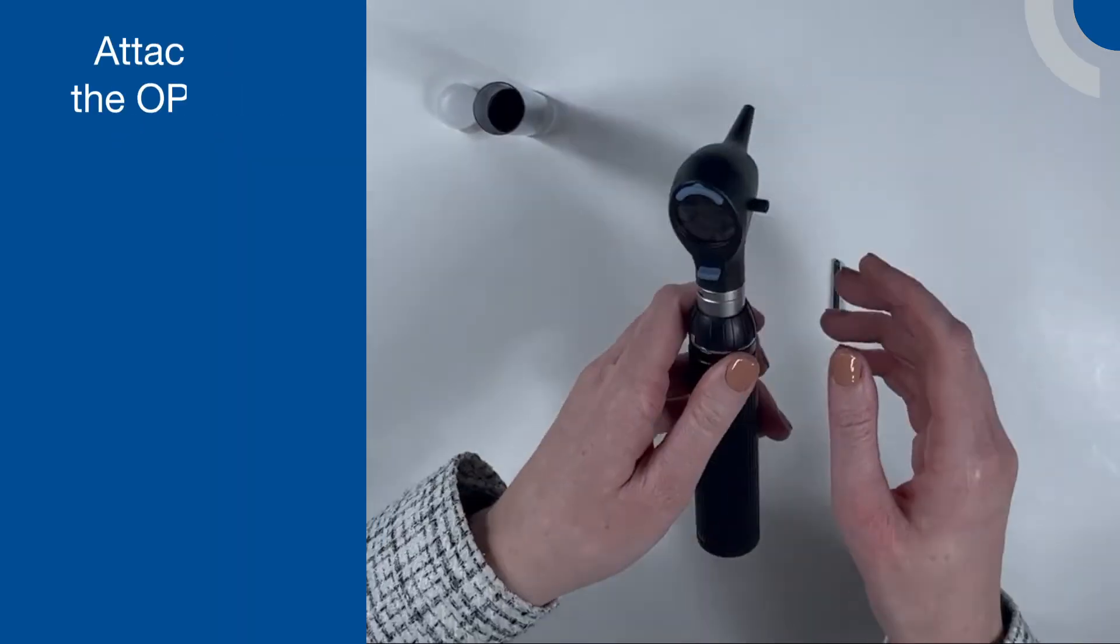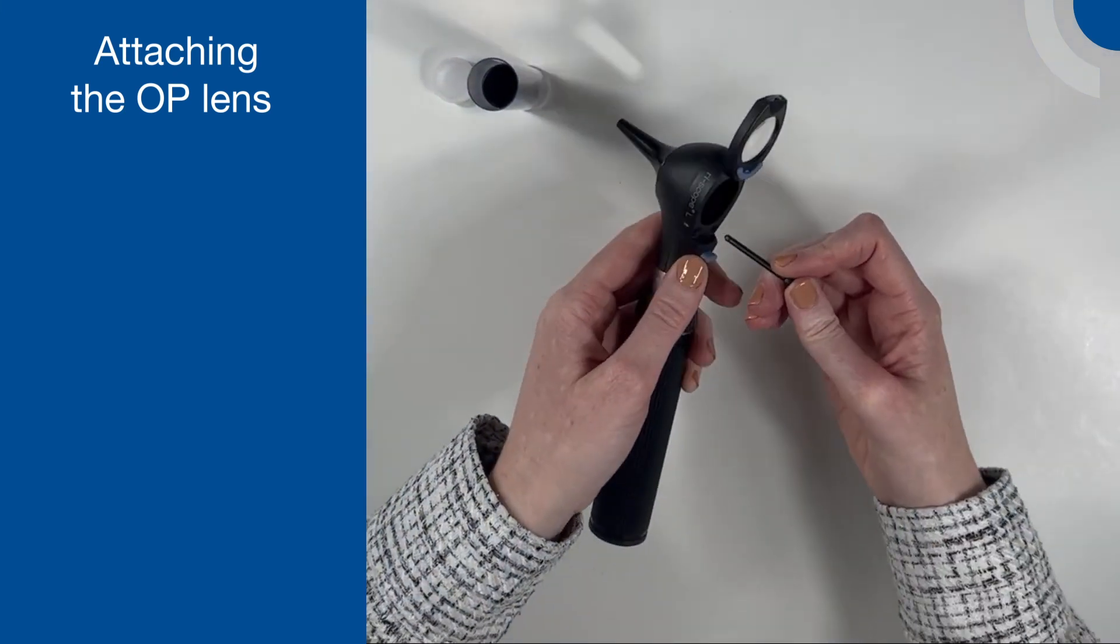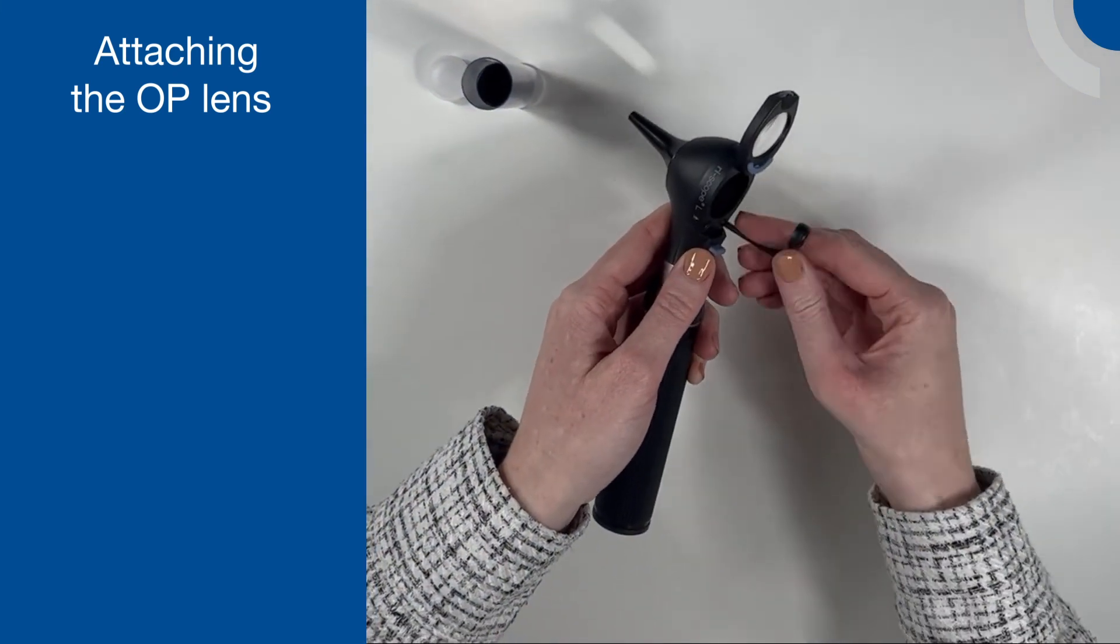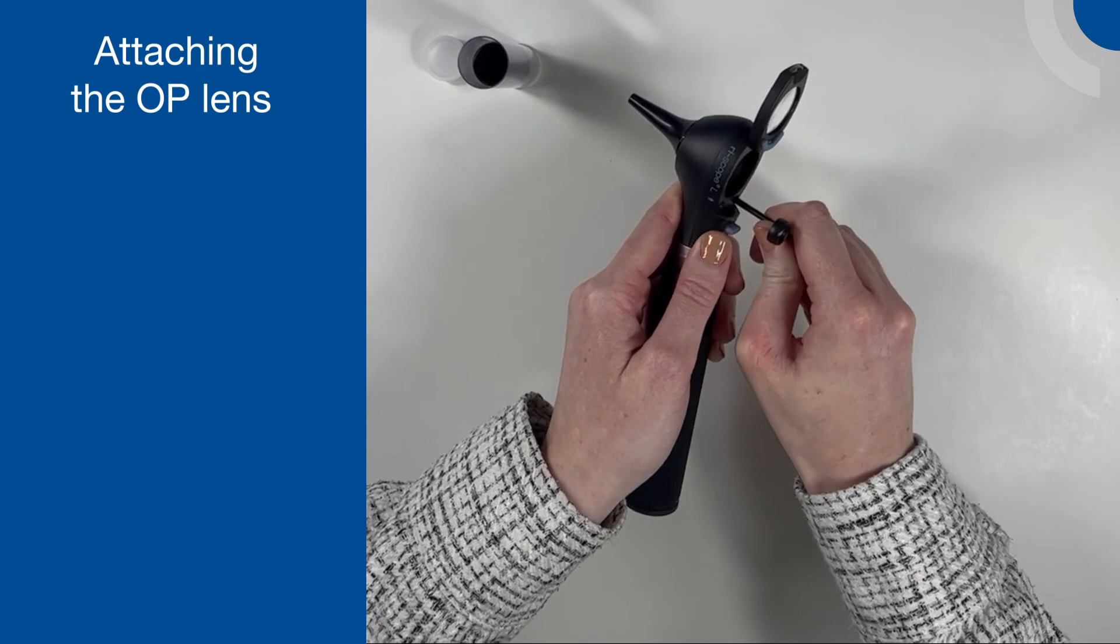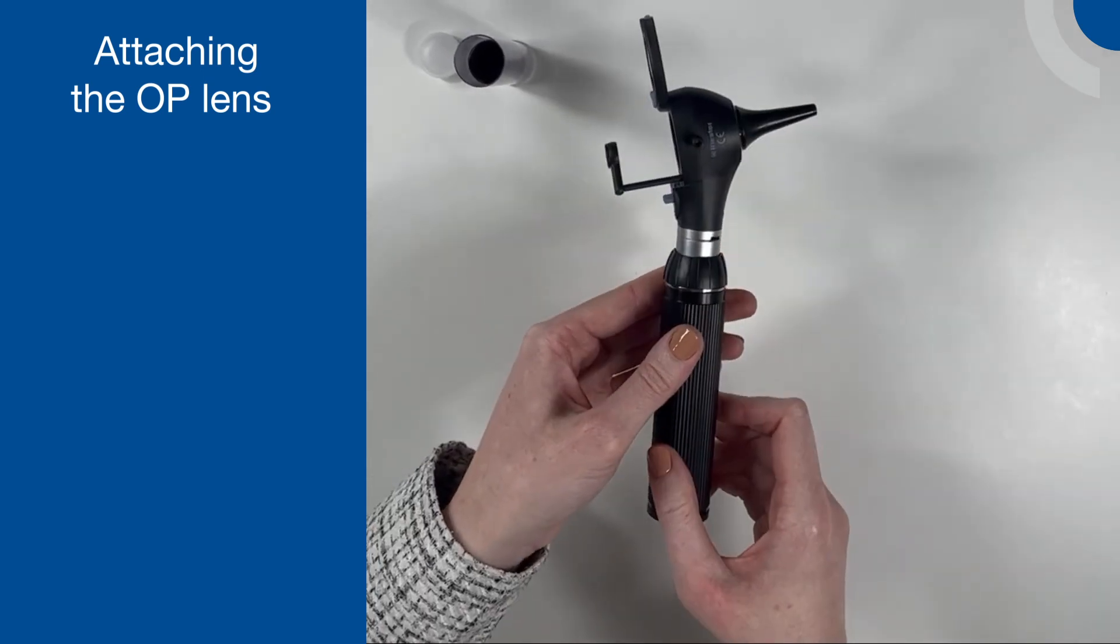To use the four times magnifying operation lens, slide the swivel lens to the side and upwards and insert the lens into the hole on the left or the right as per your preference. The lens is now ready to use.